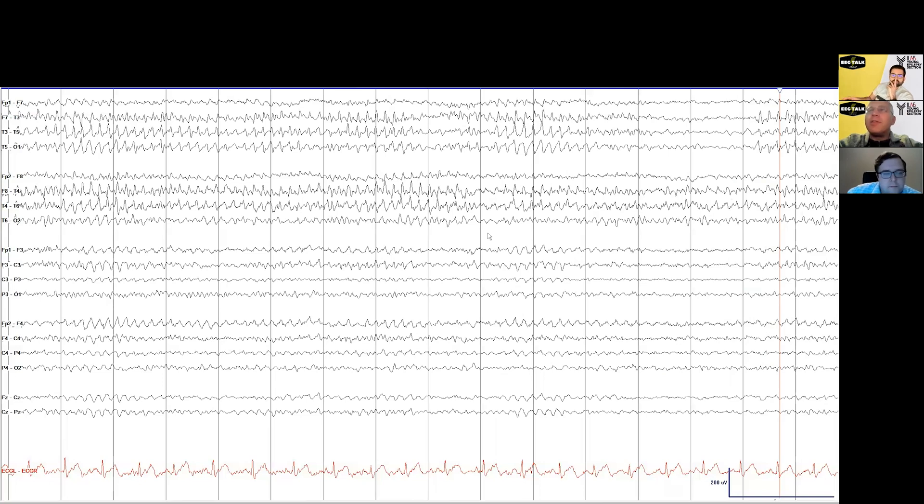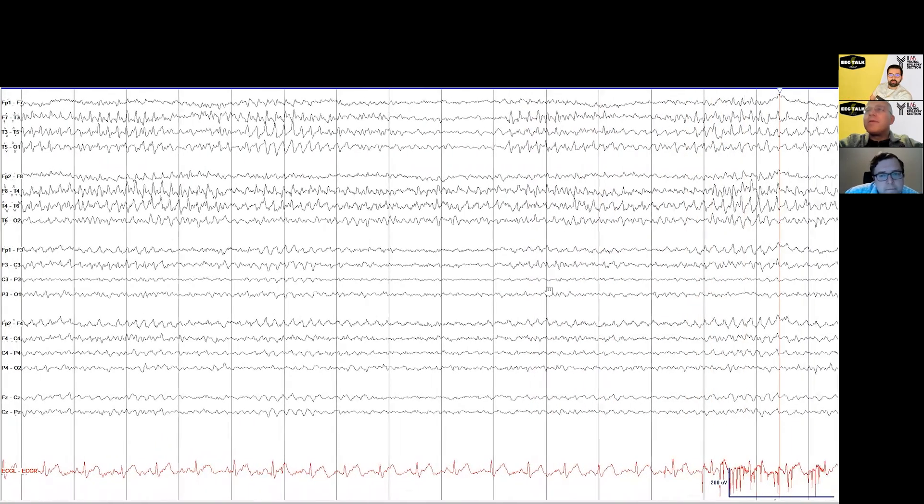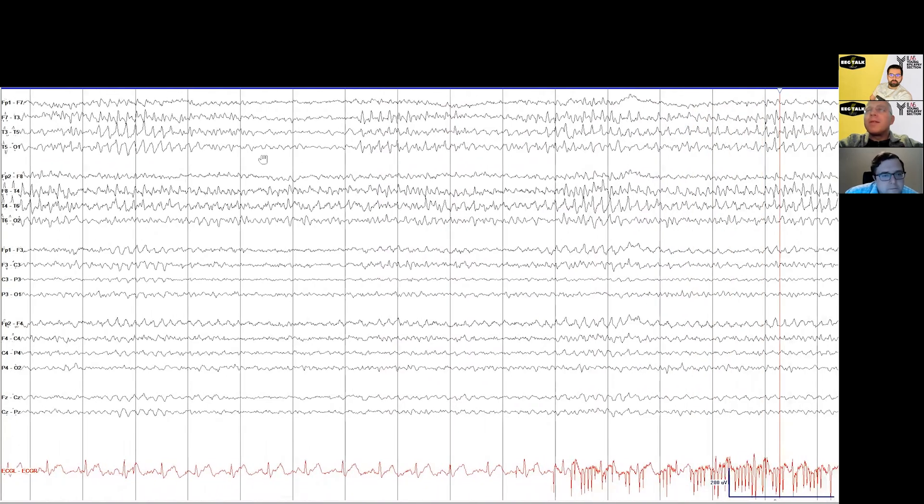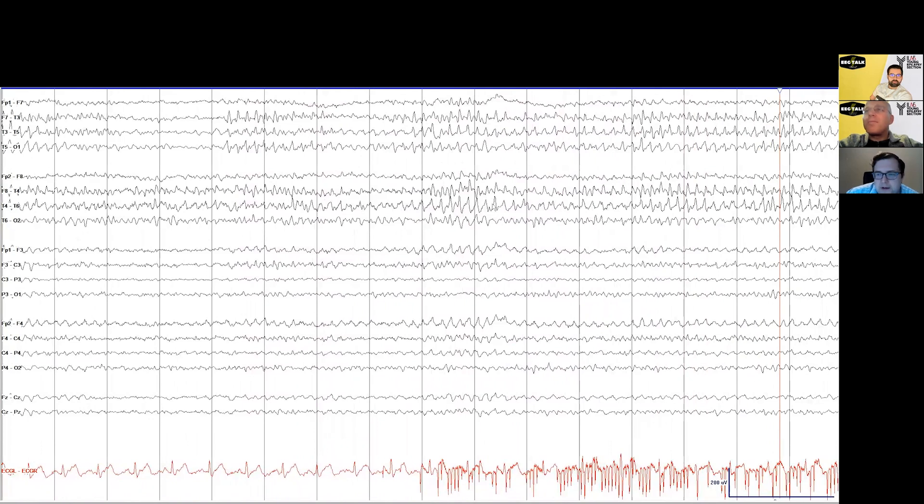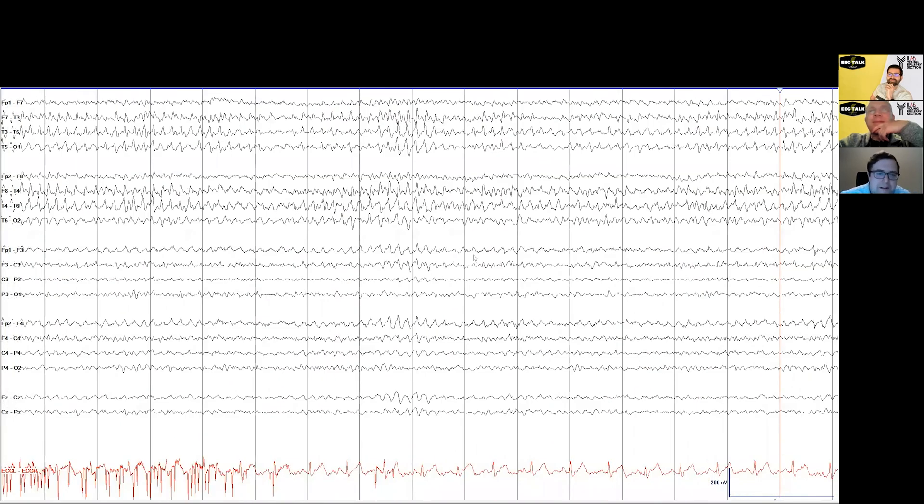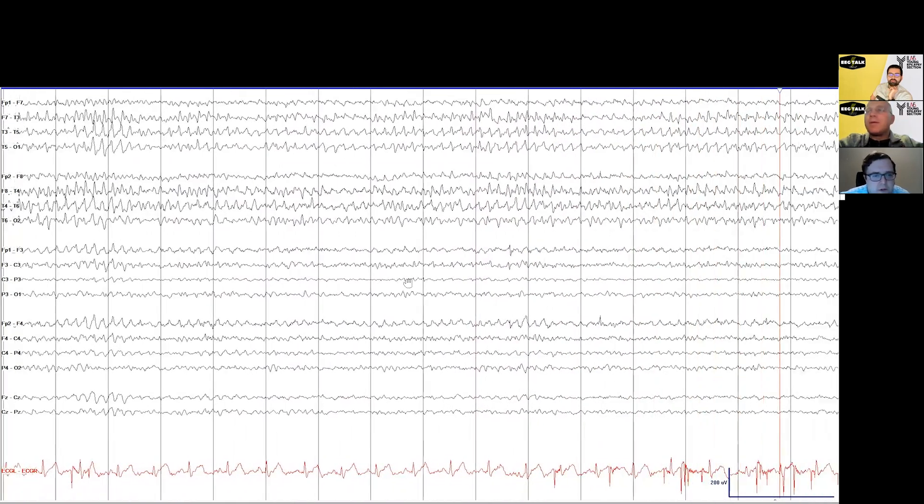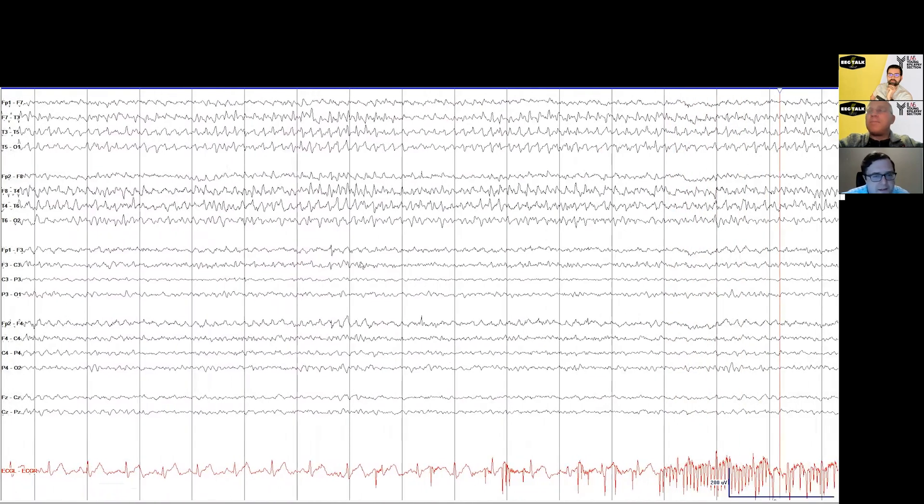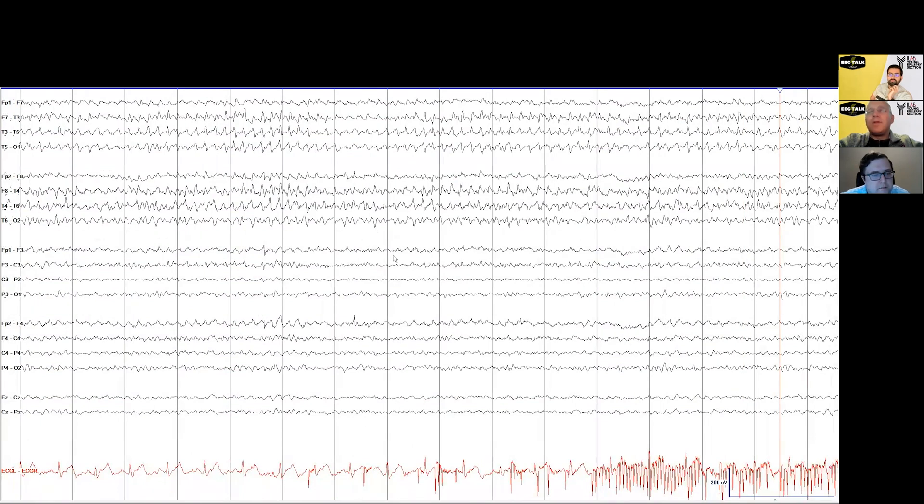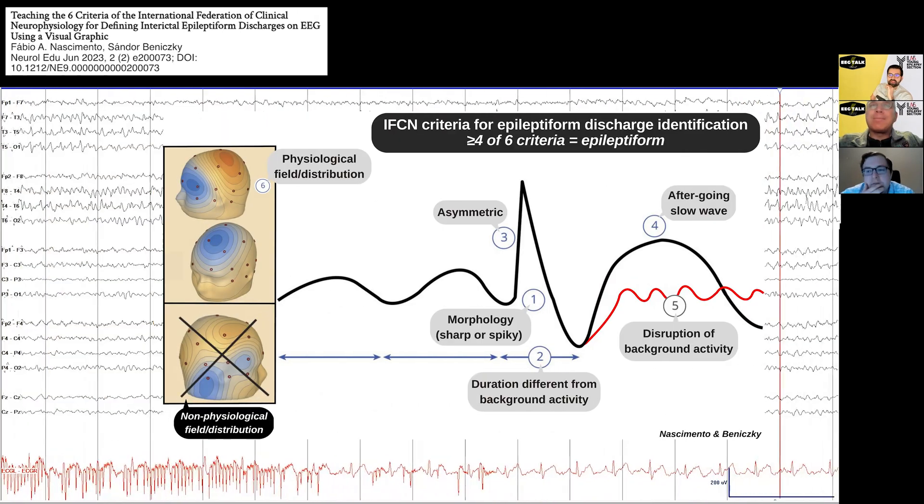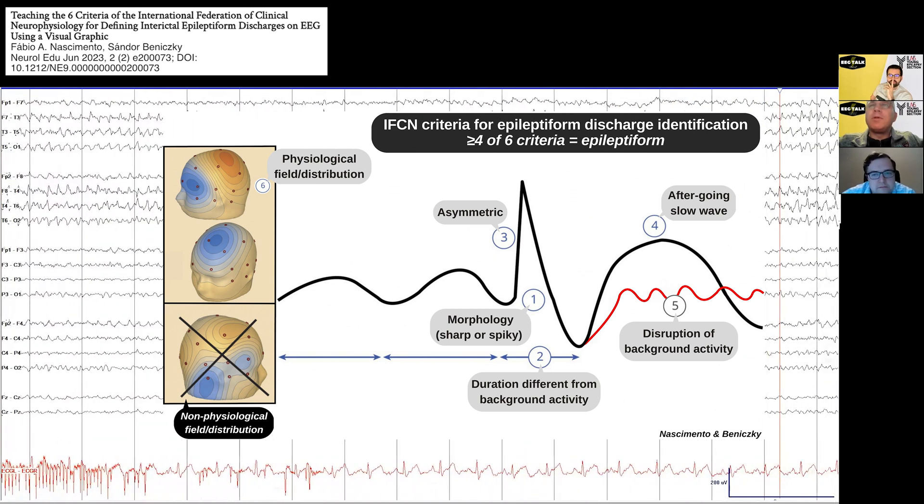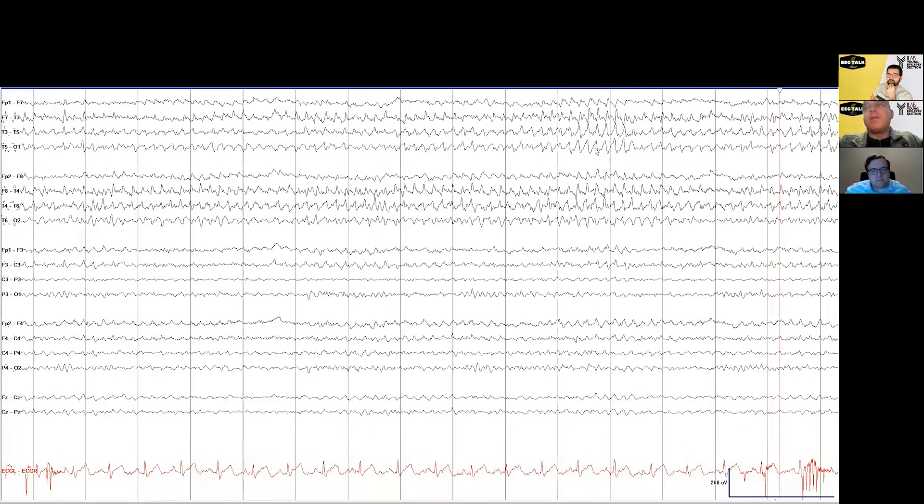Can we look at the end of this one, Fabio? It kind of comes and goes sometimes, and sometimes this one's a little more on the right, sometimes a little more on the left, as you'd like it to be, right. Not rare in adults and later adolescents. There have been cases of it reported here and there in kids, but usually it's more of an older finding. We usually go over the six IFCN criteria for this, and I did do that before you guys joined in, and that kind of convinced me. So maybe we can do that too.